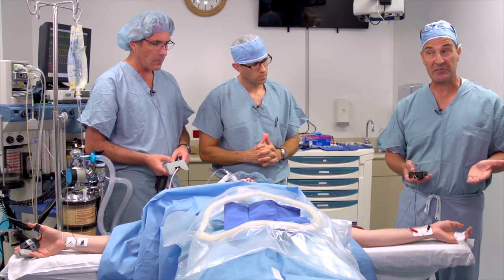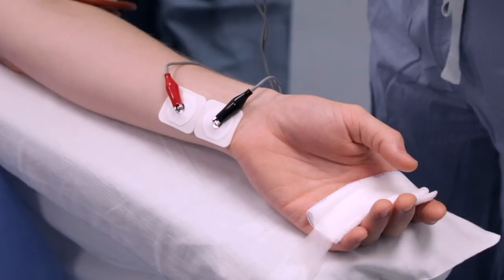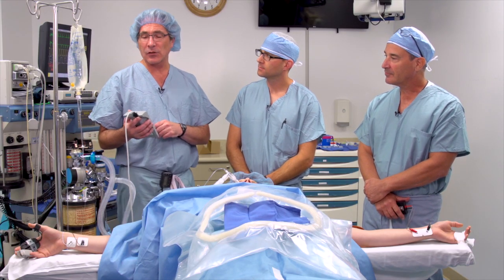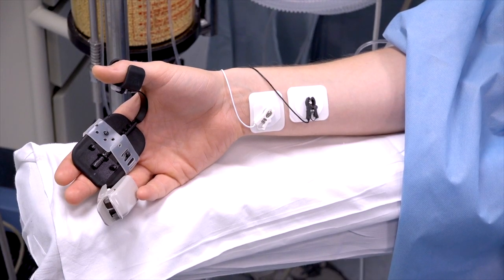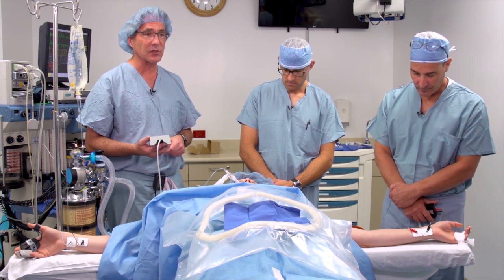We had two out of four twitches on count. We'll again do a train of four count, and we still have two out of four count, which is expected with the slow onset of neostigmine. We're turning on our quantitative monitor to check a train of four ratio, and we see the same thing — two twitches — which means we have a train of four ratio of zero.